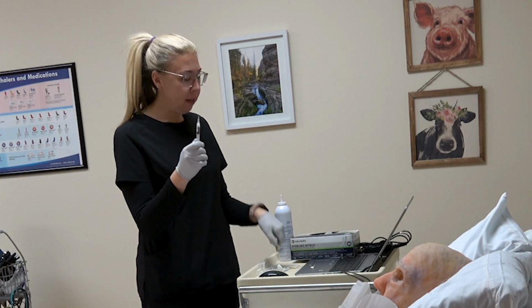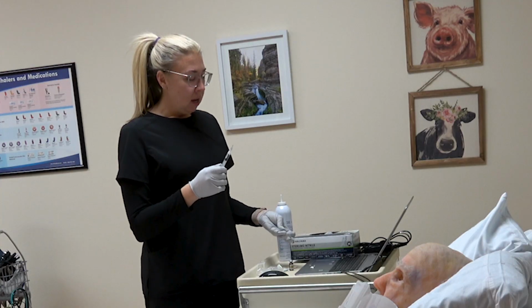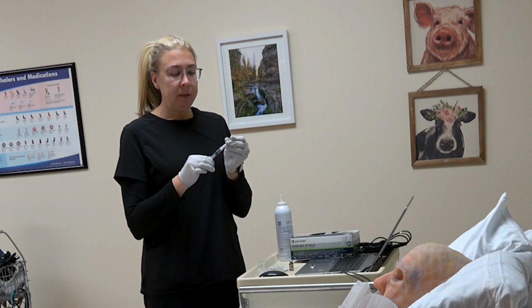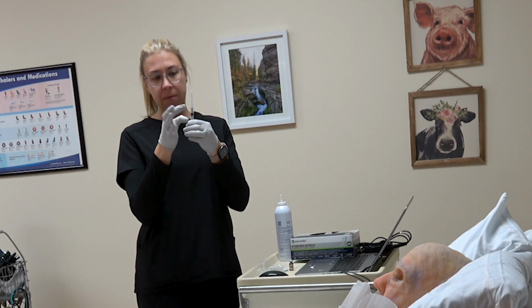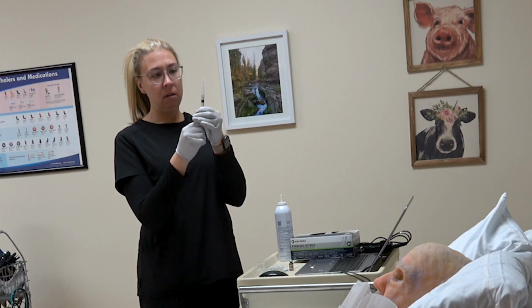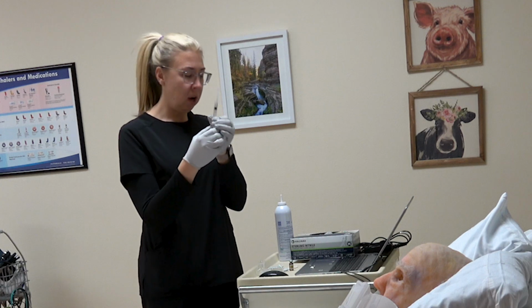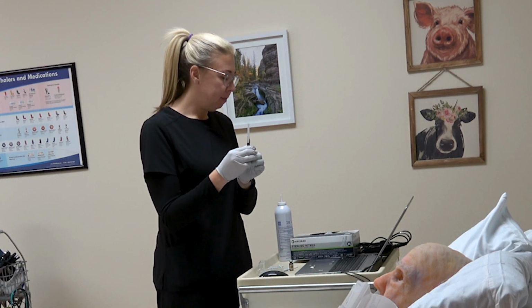Okay, got a little air in there, and that's okay. This is needleless, so you can go ahead and recap this. I'm going to go ahead and flick out all of my air and push out all the air till I get my dosage. So I have 1 milliliter drawn up. So now I have this drawn up.